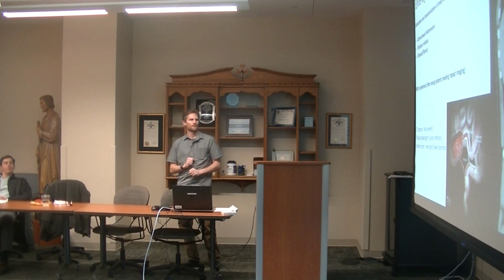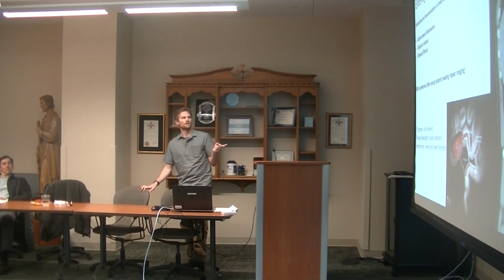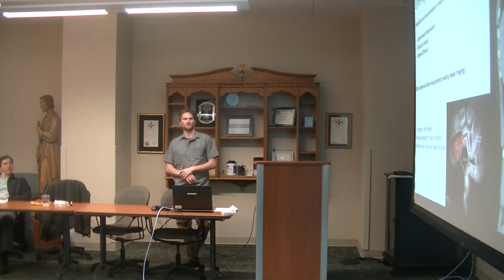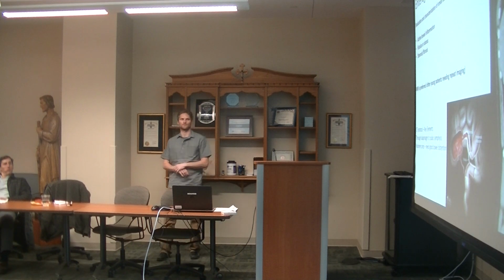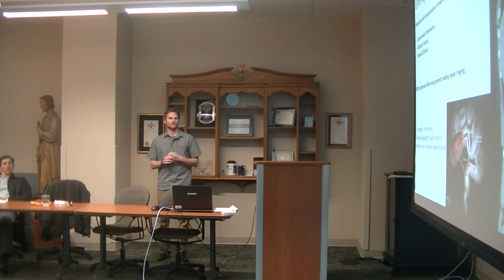a stricture. We prefer MRI for these, to do the MR enterography, because these patients are often young and they get imaged over and over again, so people are trying to be cognizant about their cumulative radiation dose over the span of their lives. But we do do these, and they can provide a lot of valuable information.